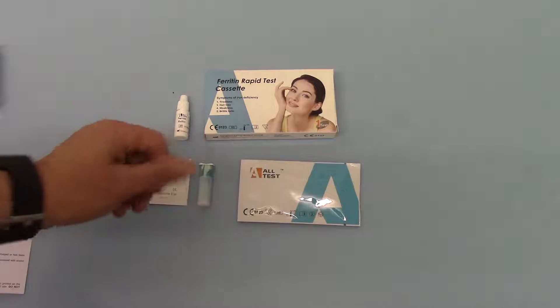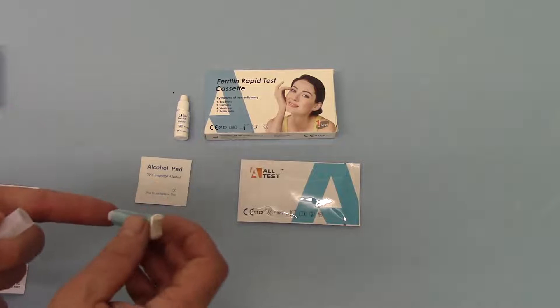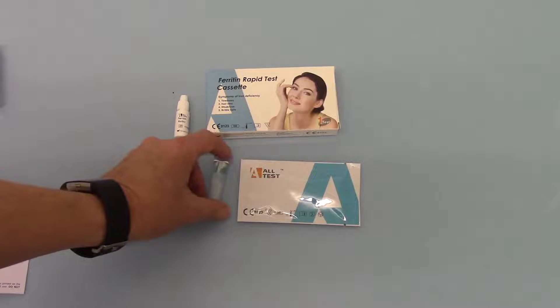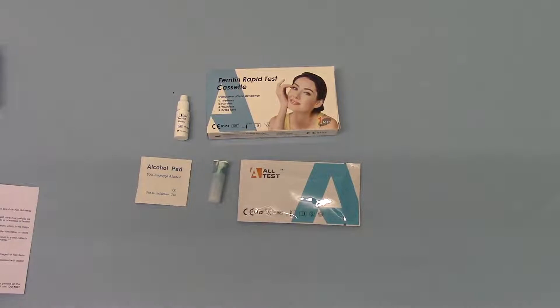To do the test, you take the lancet, remove the cover, apply it onto a fingertip and press the button down to lance your finger. Open the test cassette and you'll find a small pipette packed with it, which you apply onto the blood droplet. Through capillary action a certain amount of blood is soaked up into the transfer pipette. By squeezing the bulb on the end of the pipette you can drop a single droplet of blood into the sample well on the test cassette, then add two droppers of the buffer solution into the sample well.